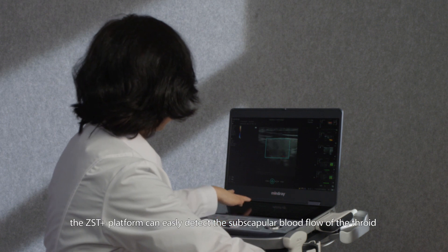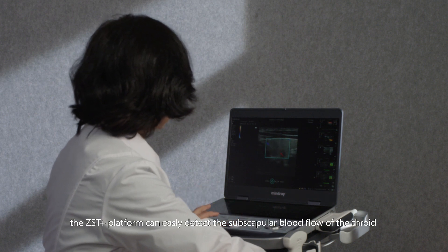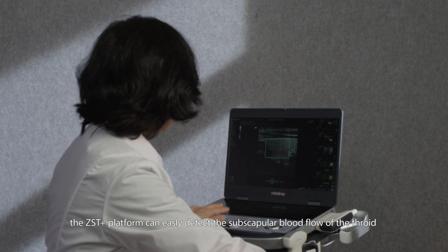In addition, the ZST Plus platform can easily detect the subcapsular blood flow of the thyroid.